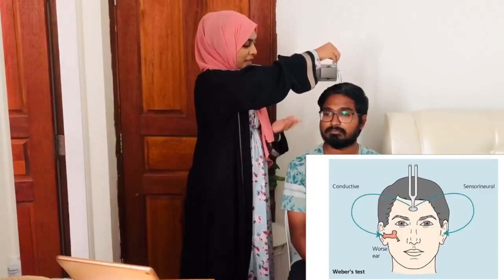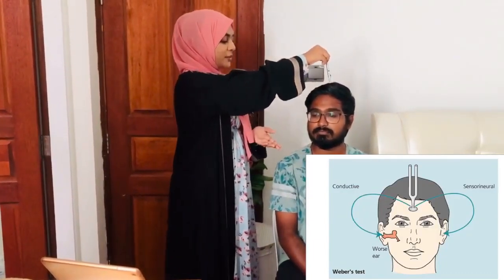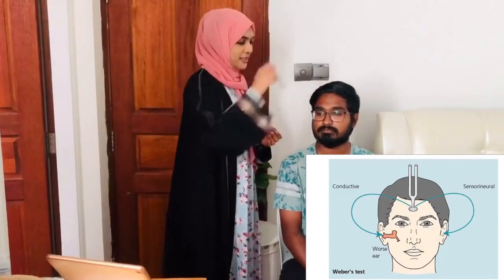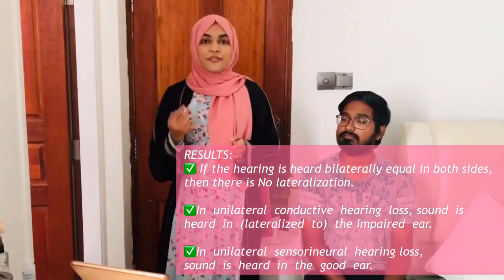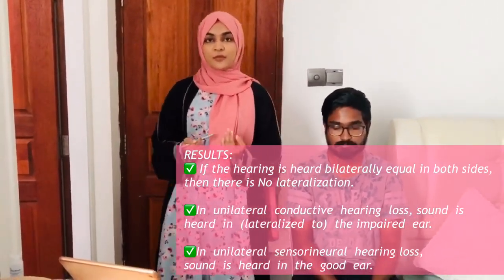So I will first put this on vibration. Can you hear the vibrations? Yes. From which side you hear it more? Both sides equal. Thank you. So after the test is done, then you will have to explain to the patient what you got.